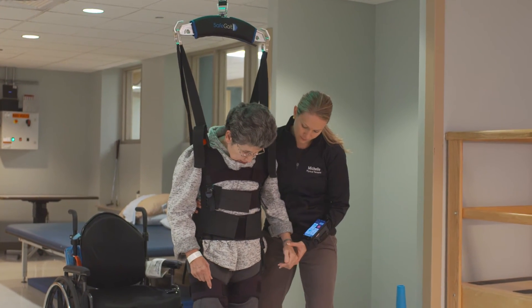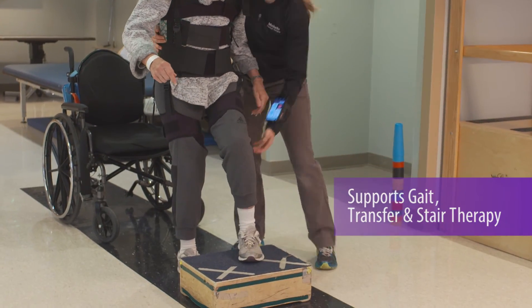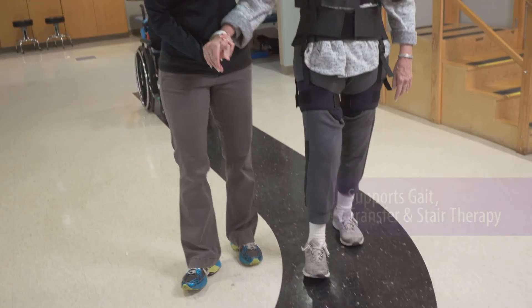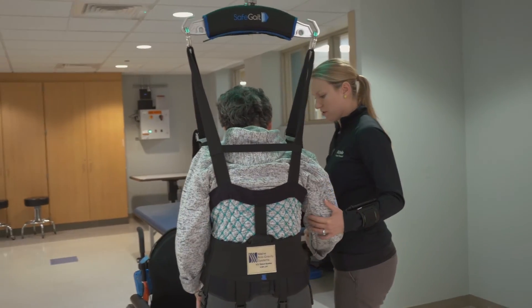In one session, a therapist can control a wide range of gait, transfer, and stair activities. Through SafeGait, Moss Rehab therapists can customize tasks and add them to the Plan of Care library.